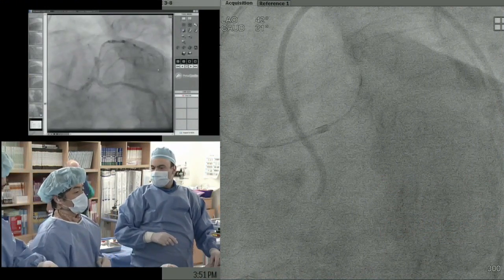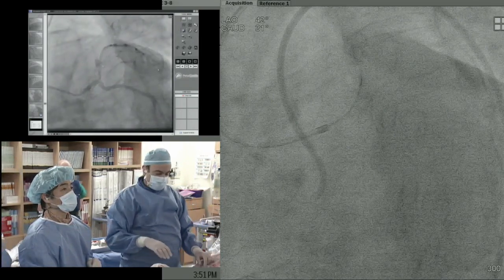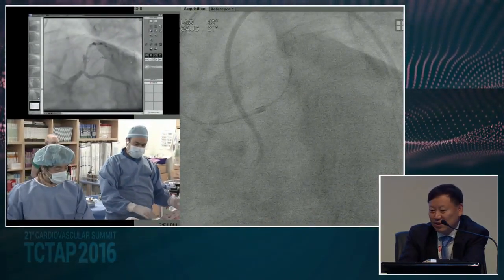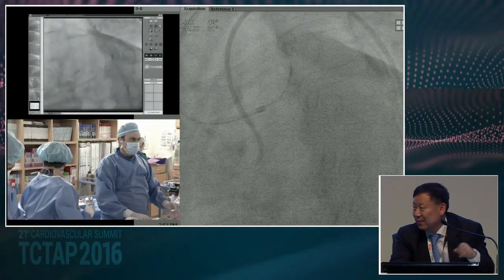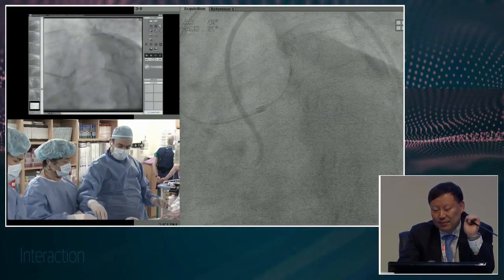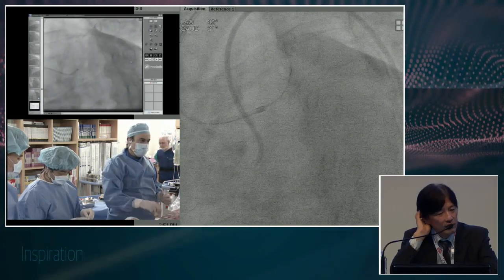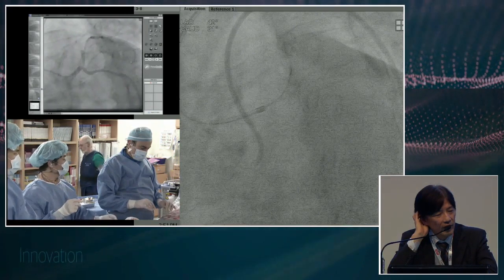Dr. Muramatsu, in this case, which microcatheter is better among them? I think I'm very cautious about the LAD just proximal calcified region. Yes, I don't like this small narrowing of the ostium. So maybe... Well, we're going to watch it very closely. So far, the EKG is fine, and the pressure is okay. He's not complaining of any pain.